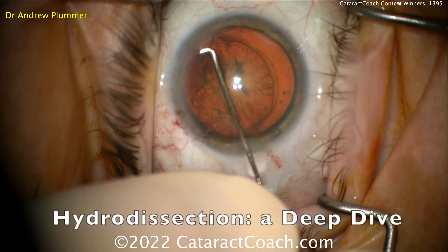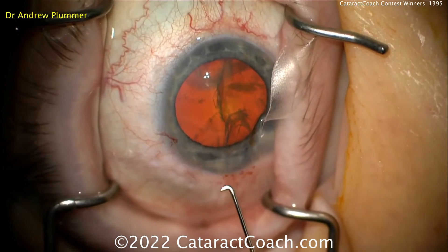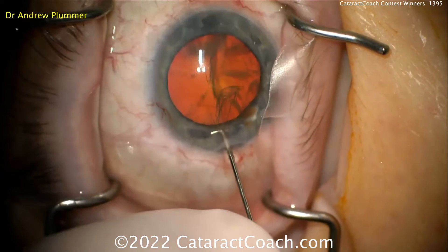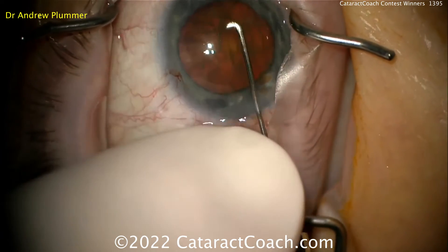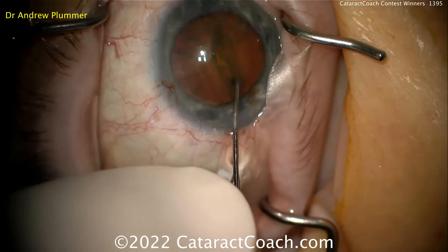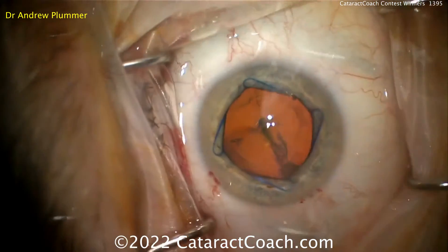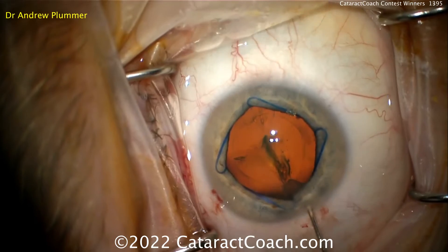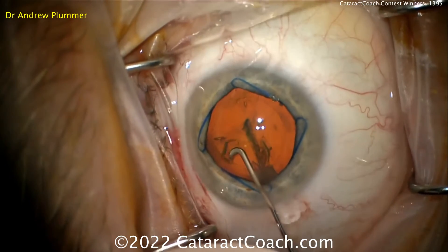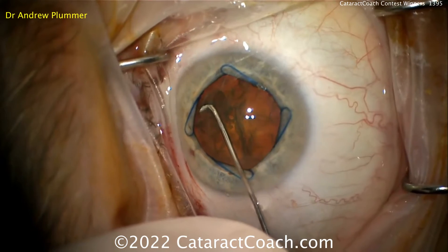Let's take a really close look at hydrodissection. The goal of hydrodissection is to free the lens from the capsule so that it can rotate. The rotation part is the endpoint of a successful hydrodissection. Like most people when you're starting out, my technique was just kind of spray and pray. Even when I got a fluid wave, the lens didn't want to spin. I could send another fluid wave from a different quadrant and still had a lot of trouble and a lot of resistance to that spinning.